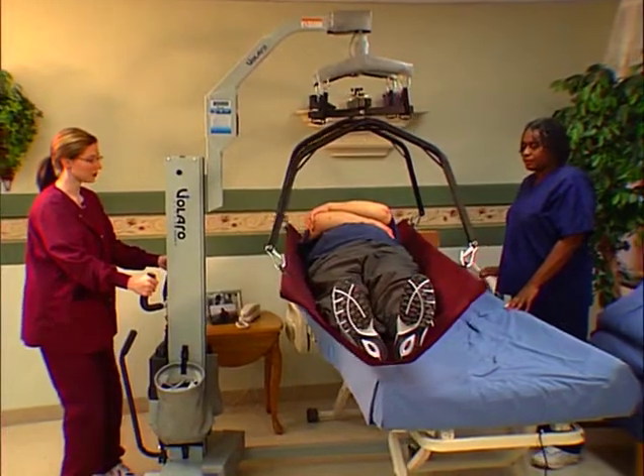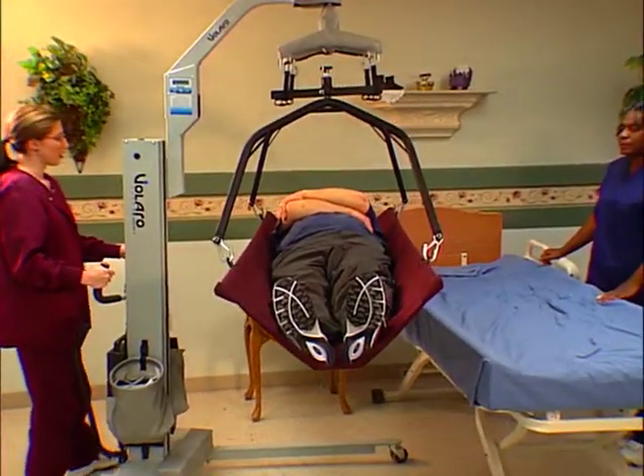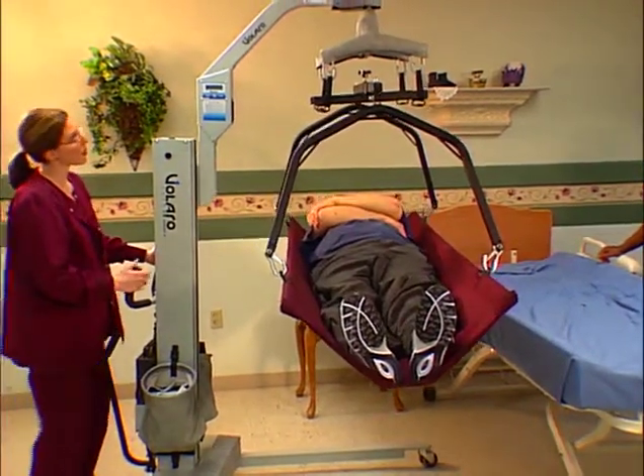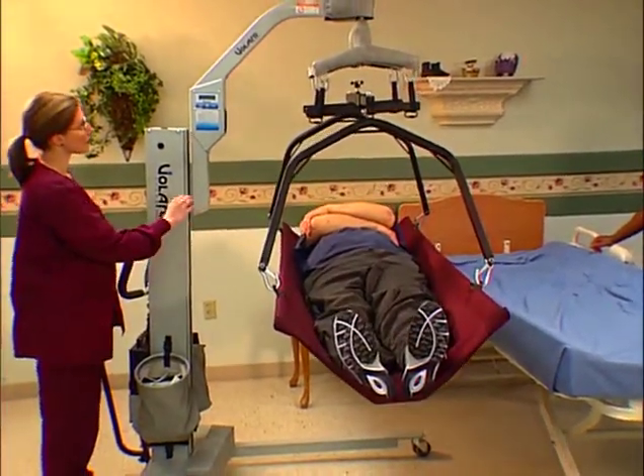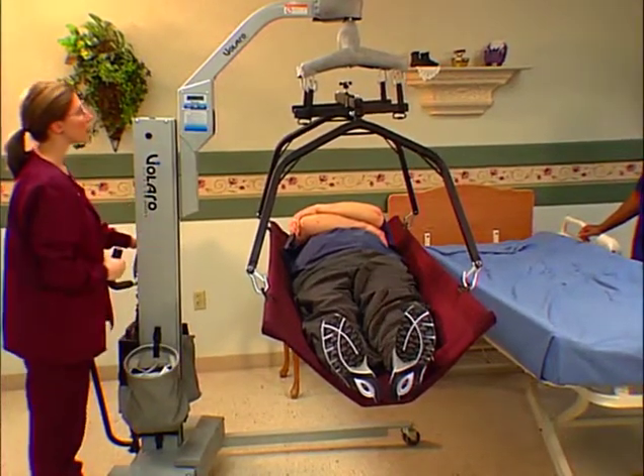You are now ready to weigh the patient in the lift. After the sling or other accessory has been properly placed around the person and is connected to the lift, raise the person clear of all objects. Hold the person in the raised position for 10 seconds to lock in the weight reading.